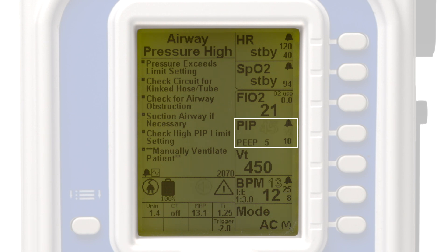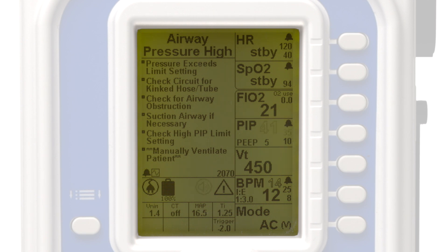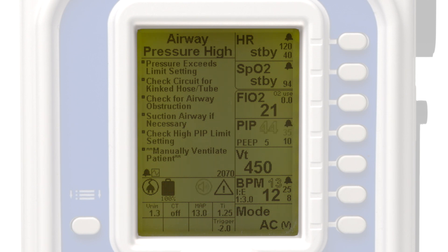In the corresponding parameter window of an alarm, the values that triggered the alarm will flash. In this case, the peak inspiratory pressure or PIP window, the high limit alarm number, and current PIP value are flashing. Continue to follow the on-screen Smart Help prompts to resolve the alarm.